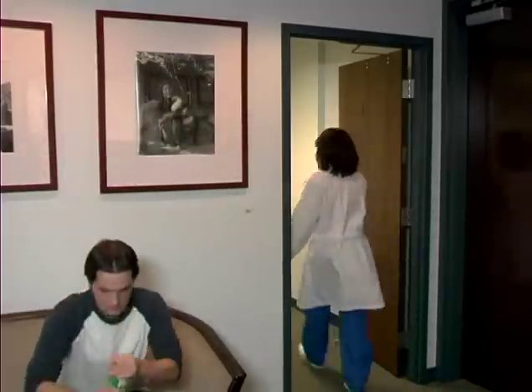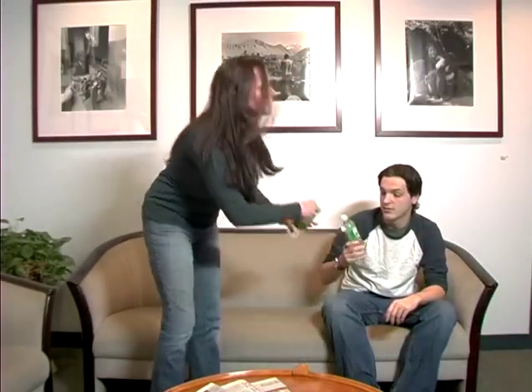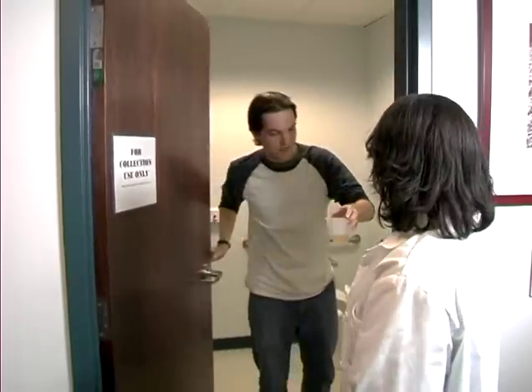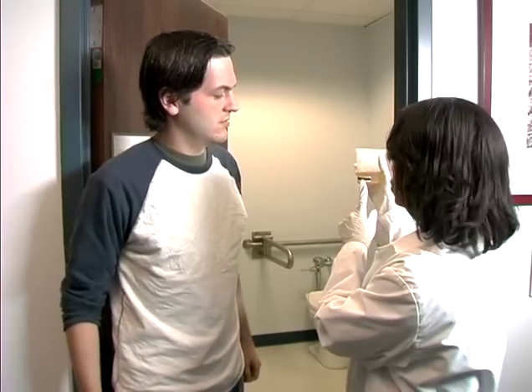During the 3-hour period, the donor must be monitored by the collector or another responsible collection site employee at all times. Continue using the same CCF, being sure to document the time of each attempt, the amount of the specimen, and the amount of fluids the employee was given to drink on the remarks line of Step 2 of the CCF. If the donor provides a sufficient quantity of urine within 3 hours, follow the routine collection procedures to prepare the specimen for shipment to the laboratory.